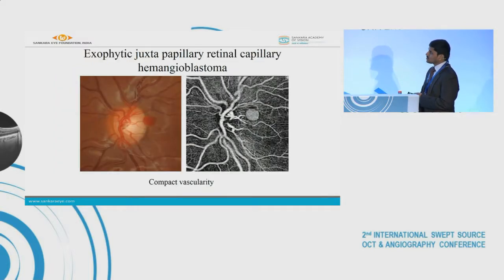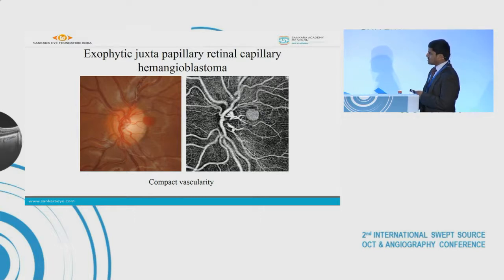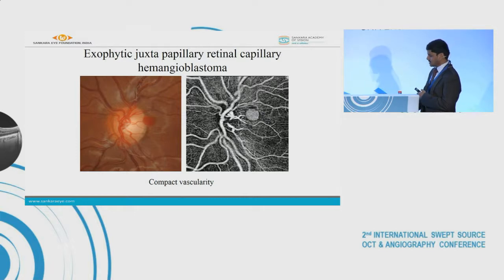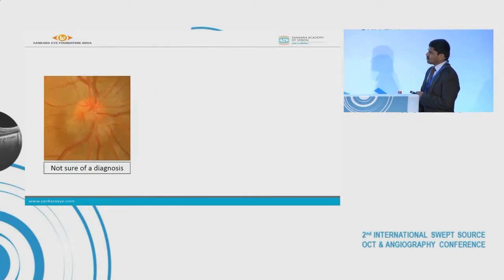In this case the diagnosis is quite certain — it's an exophytic form of juxtapapillary retinal capillary hemangioblastoma. On OCTA, as seen in peripheral retinal capillary hemangioblastoma, it has a compact vascular signal with hardly any intervening spaces.